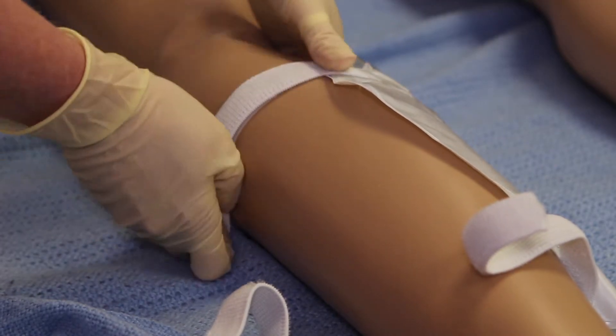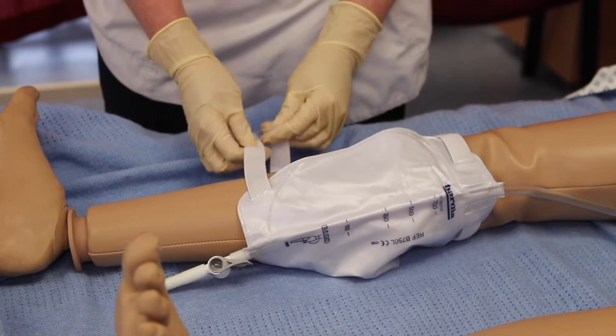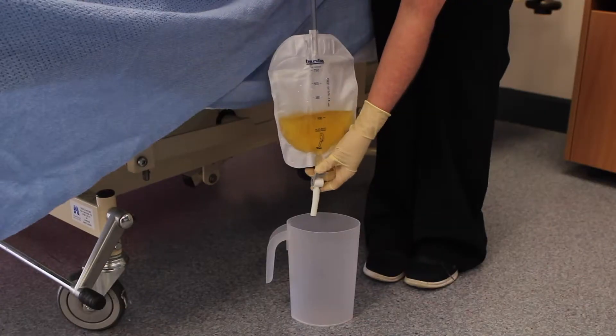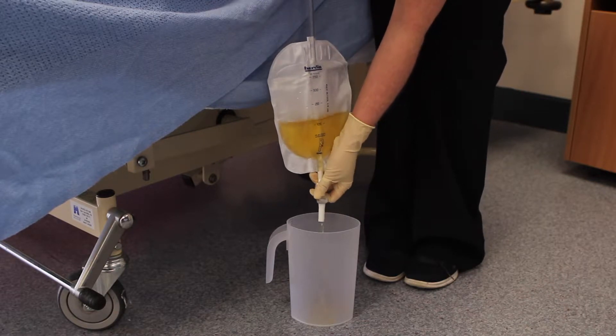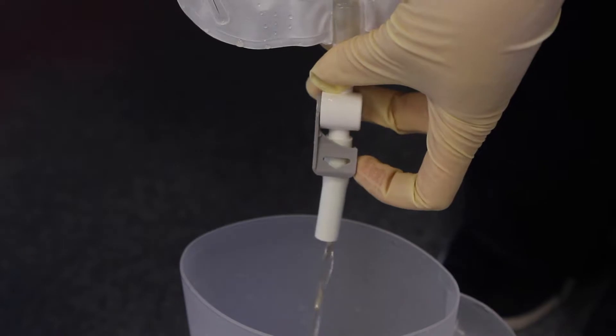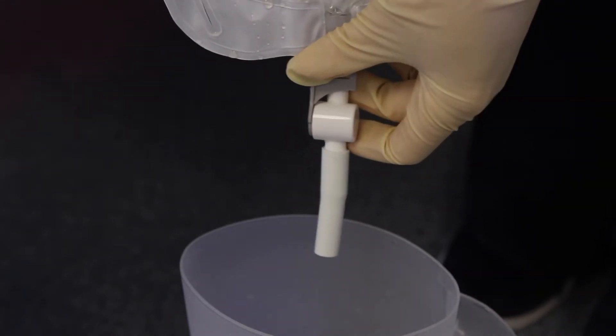A leg bag can be fastened to your leg by using the straps provided. Leg bags should be drained when half full to avoid excess tension being put on the urinary catheter. To drain the leg bag, position the tap downwards and drain into a clean container or toilet. When emptied, reposition the tap to the upward position.